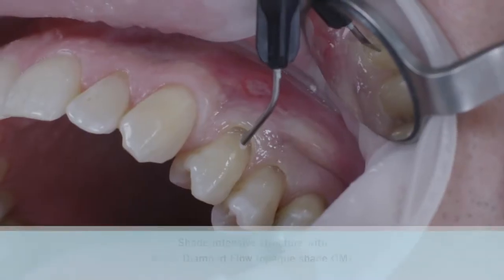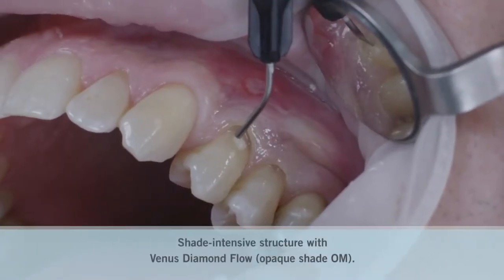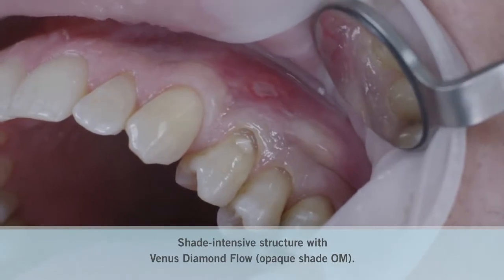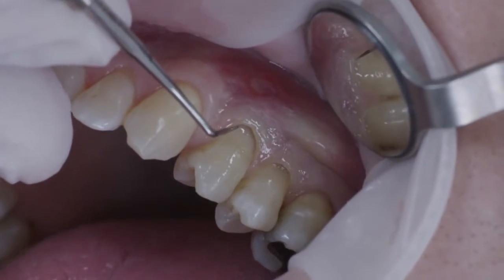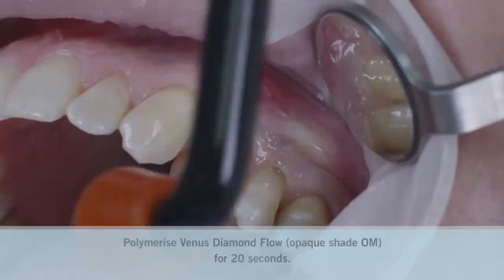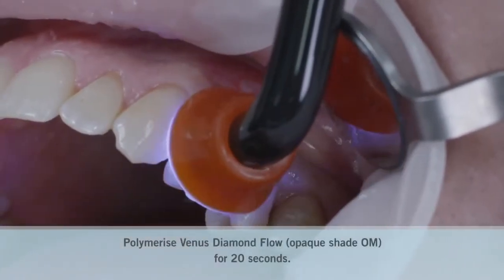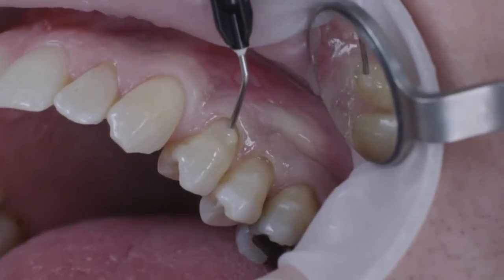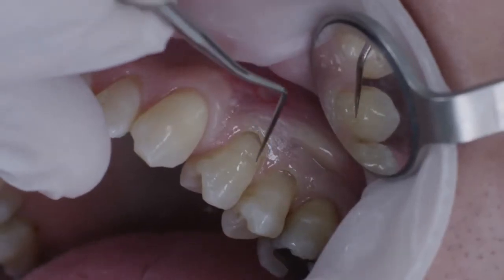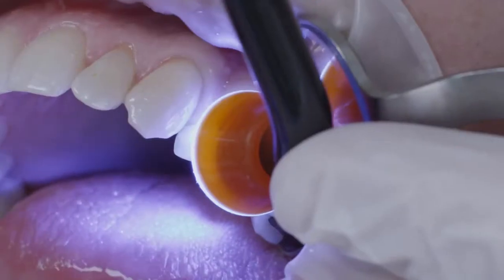On tooth 2.4, I began with shade OM, or opaque medium, of the flowable nano-hybrid composite Venus Diamond Flow. It was placed at the center of the cavity in order to create a shade-intensive structure. Once light curing had been completed, I added further layers of Venus Diamond Flow A3. Using the probe, the material was carefully adapted to the preparation margins, and light cured accordingly.